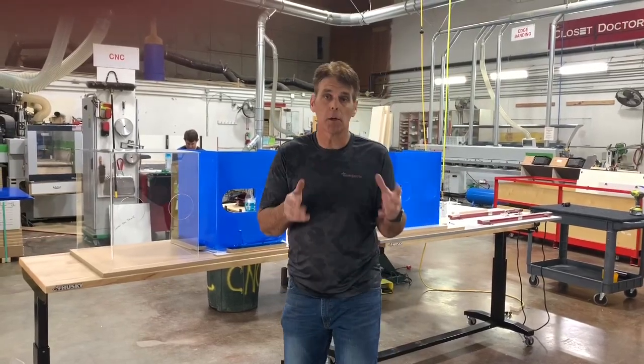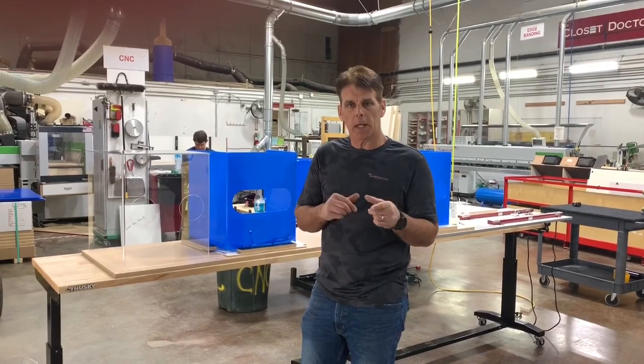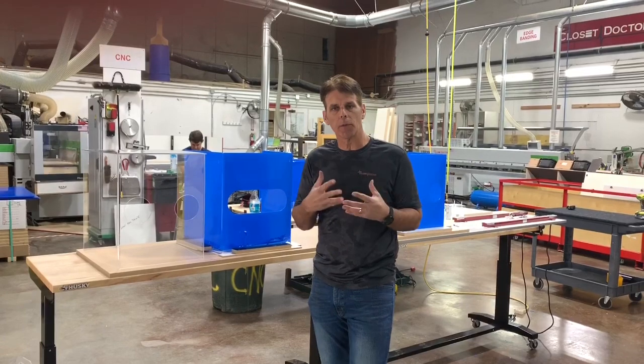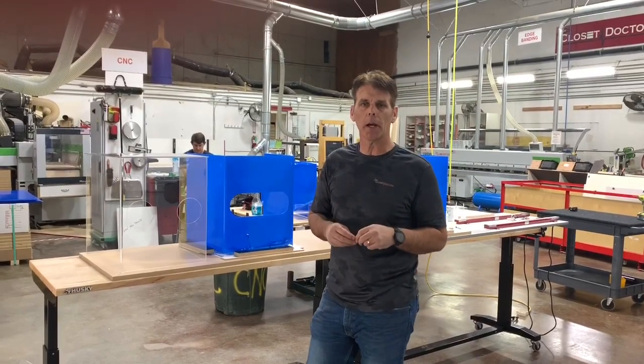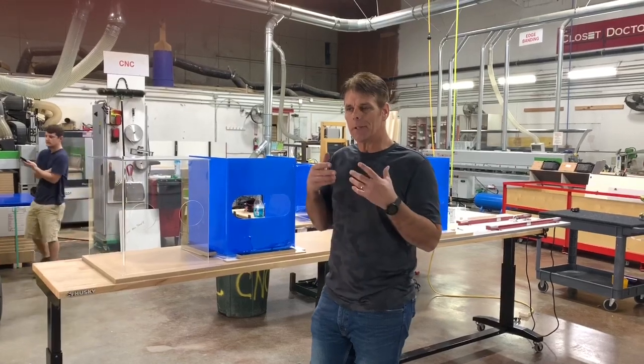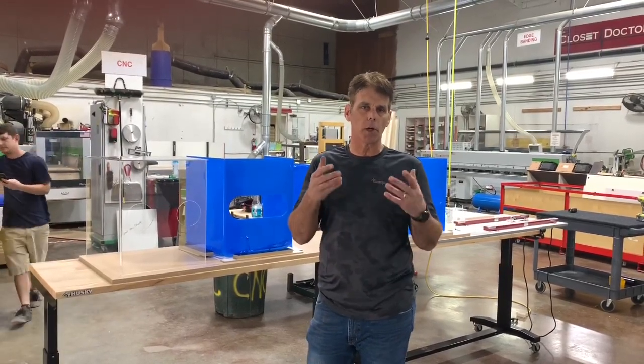Hi there. If you are a medical personnel treating people with the coronavirus, you want to take a few minutes and watch this — we have a product that might help you out. My name is Derek Holland. I own The Closet Doctor in Lincoln, California. We have a state-of-the-art shop that we've retooled to build devices that can help people in the medical industry that are treating people with the coronavirus.